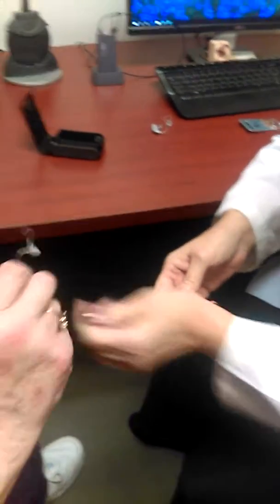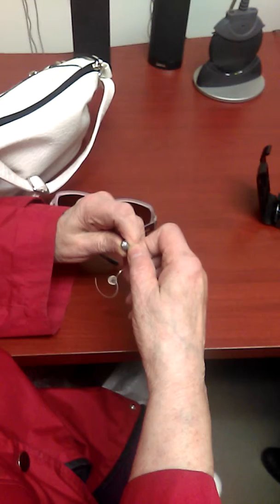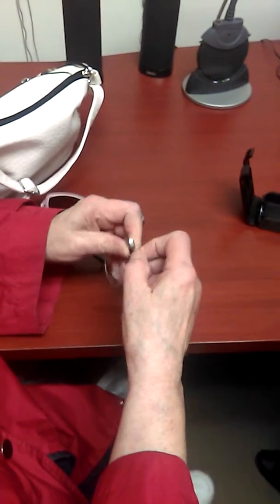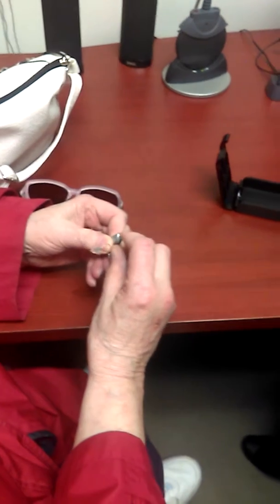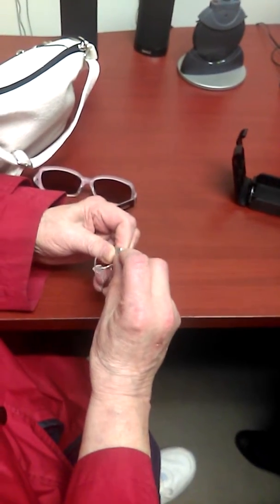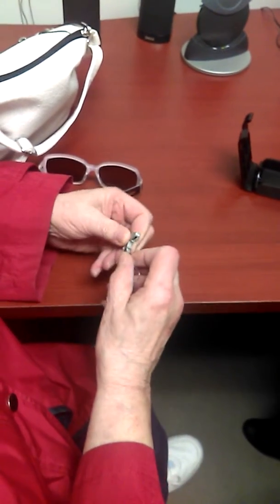Okay, I want you to open that. Let's see here. We've got all the time in the world — my patient just canceled. Excellent. Okay, pull it open. We have to get that battery in there, so pull it open. There you go.